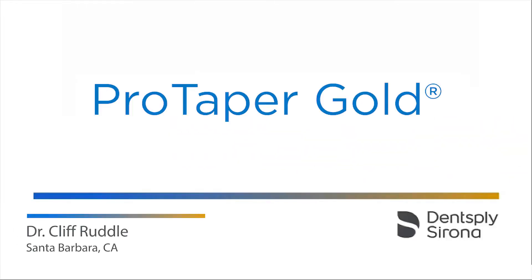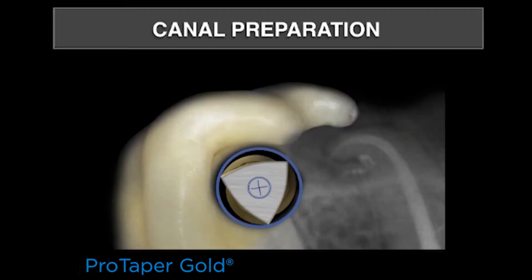Let's talk about canal preparation featuring Protaper Gold. It's important to know that Protaper Gold has exactly the same geometries as its predecessor, Protaper Universal, and it has a convex triangular cross-section and a centered mass of rotation.